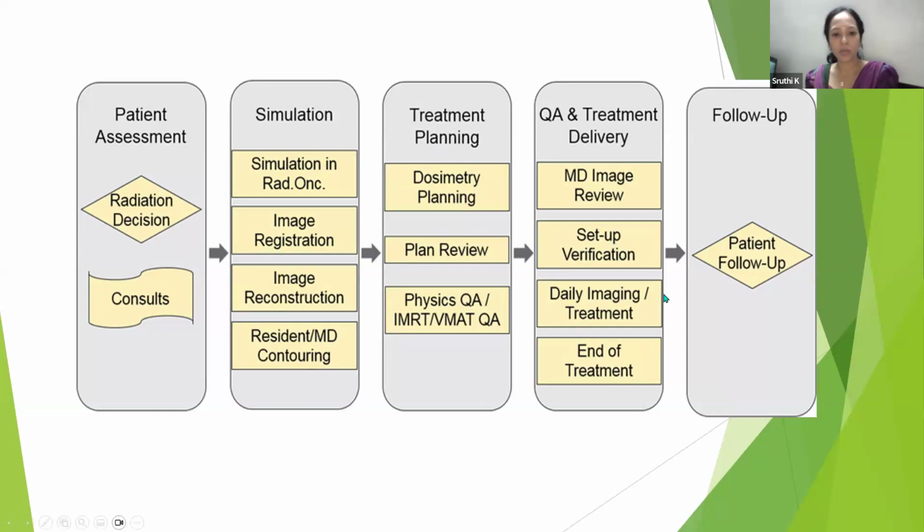And during the course of treatment also, there is a strict QA procedure for every machine. The quality assurance check is very important. And it again is based on different machines and techniques as well.